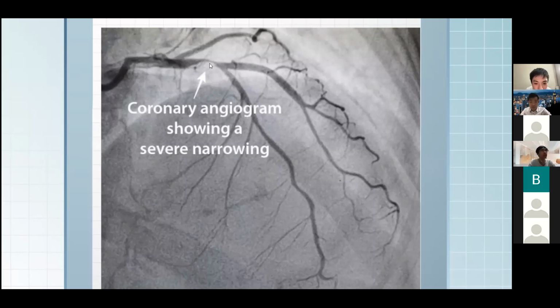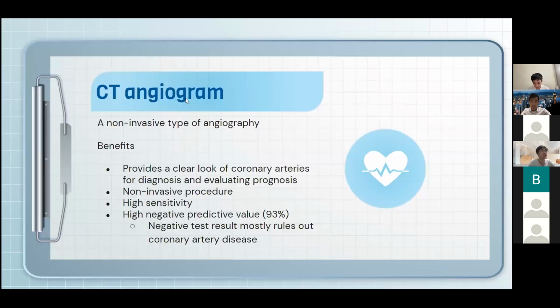There's also the fact that the structural change as shown in this diagram is actually very severe. Most of the time, when someone has a heart attack, they will have some structural changes, but there are some patients that do not show structural changes yet they already have heart attacks because, for instance, there's a thrombus or there's a segment of narrowed artery that is otherwise usually through. But in this case, something happened, say, for instance, a thrombus, as I mentioned, and that causes a heart attack, but that cannot be visualized on an angiogram.